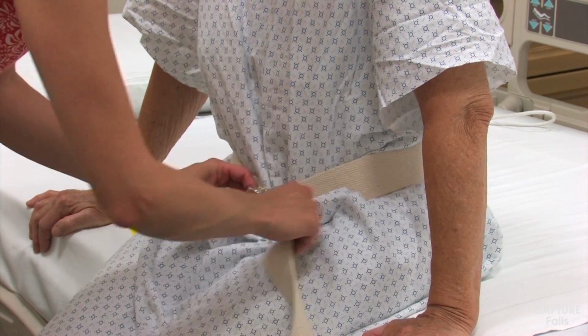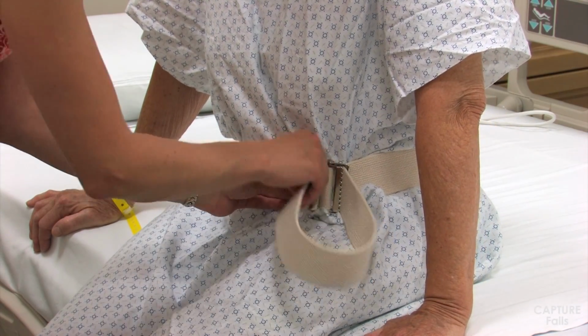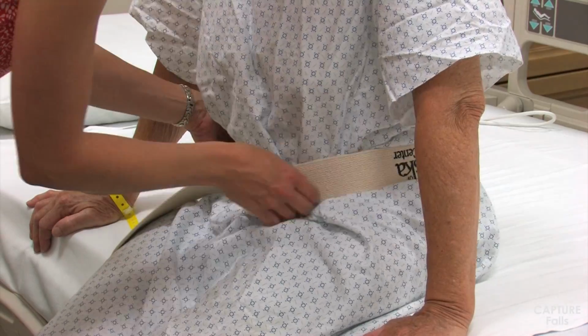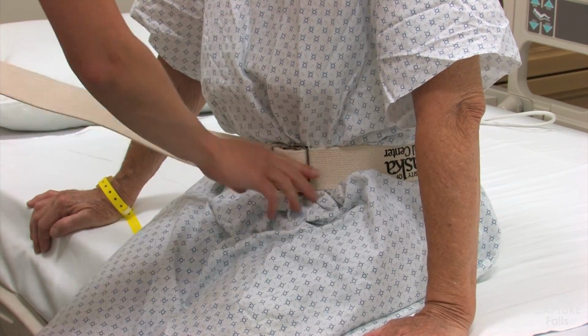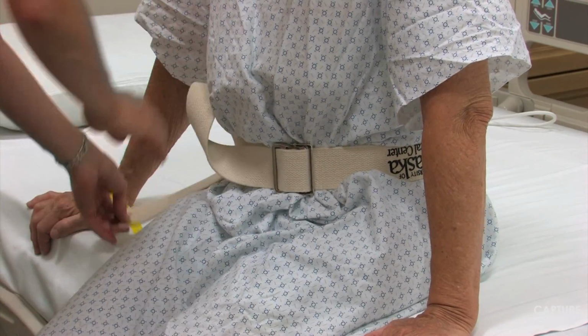The belt should be applied fairly snugly on the patient, tight enough that it won't slide up excessively on the trunk when the patient stands up, but loose enough that you can slip your fingers underneath the belt. In general, you should place the belt a little tighter than you might think with the patient sitting. It tends to loosen up a bit once the patient is in standing. Sometimes you will need to tighten it further once the patient is in standing.